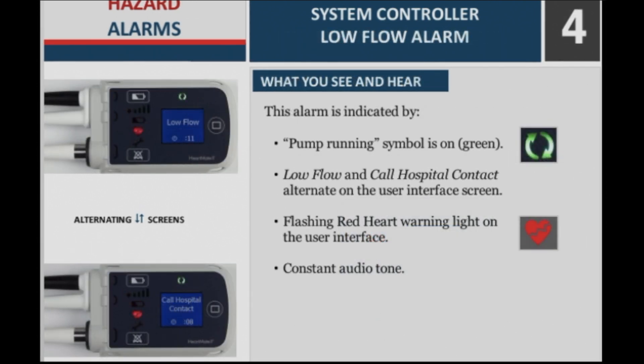System controller low flow alarm — what you see and hear. This alarm is indicated by: the pump running symbol is on (green); low flow and call hospital contact alternate on the user interface screen; a flashing red heart warning light on the user interface; and a constant audio tone.